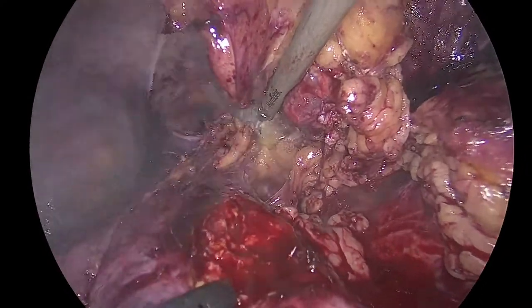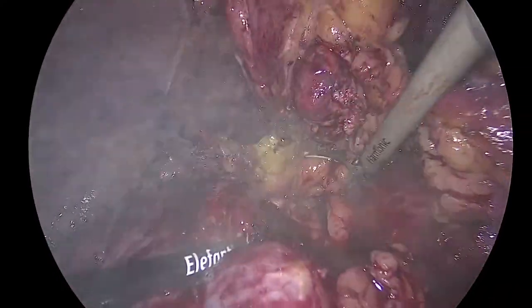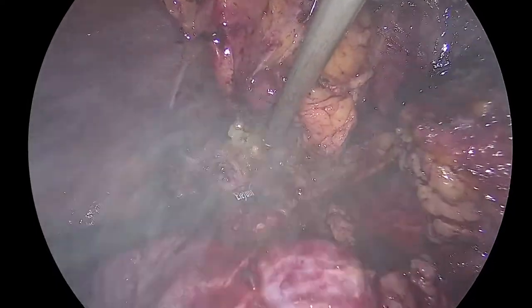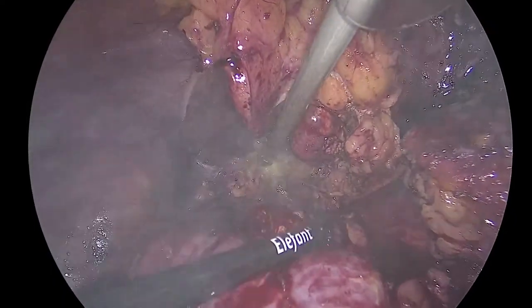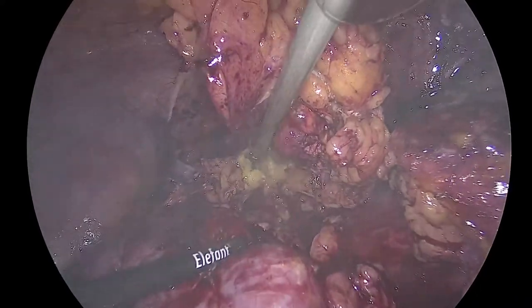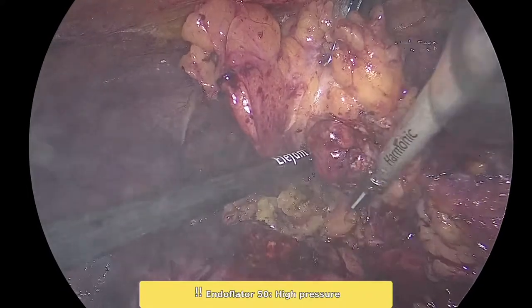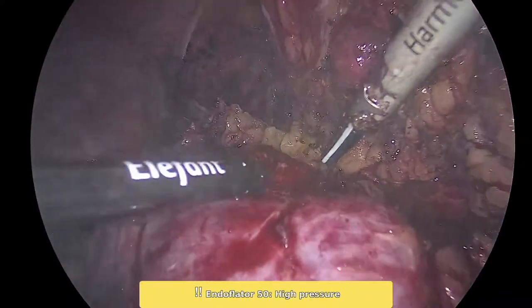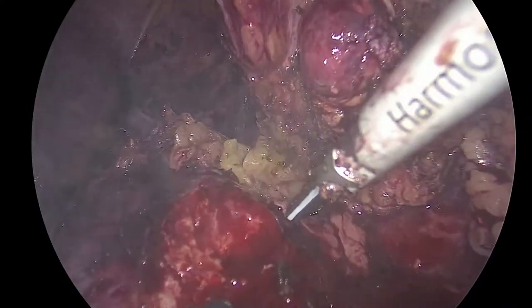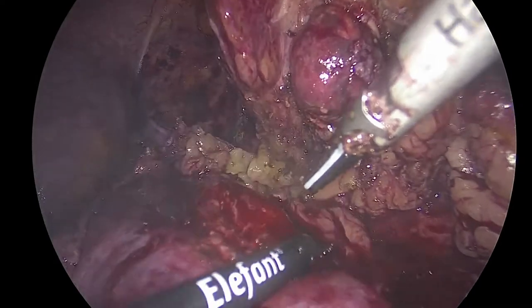There's a debate here on a positive potential margin. We will see it. I cut this first. We haven't clamped, we have time, so it's another. But look, you mean this side here? Show me, come in. This here, okay. So you want me to go deeper? Okay, give me the bipolar.